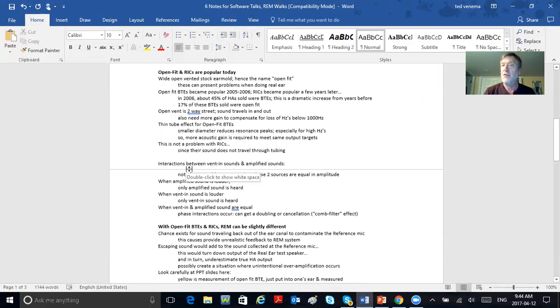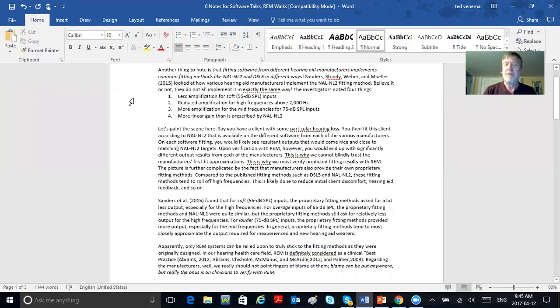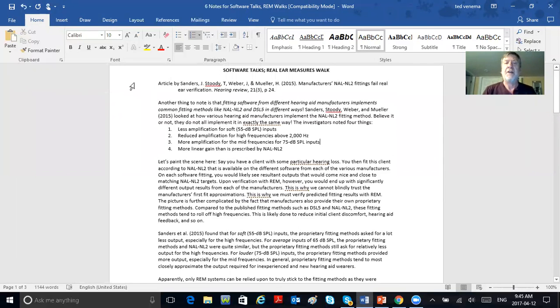For today's notes, I believe it's Unit 6: real ear walks, or manufacturer fitting software talks, real ear measures walk. That's the topic today, and you have from here on down. But I added something at the very beginning, and I'm going to challenge you to check this out on the internet. Look this up and write this down or look at this very closely.